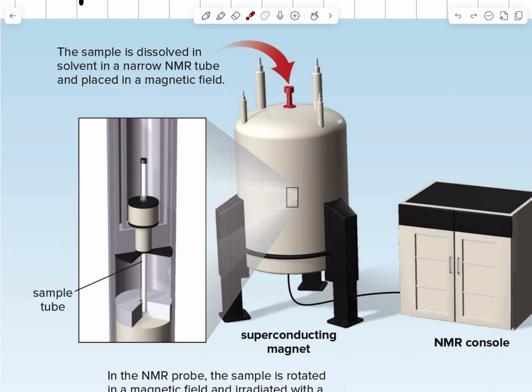Well, it would be really expensive to have to plug that in constantly, so the coils are made out of a metal that's superconducting at low temperature. You cool down the coils with first liquid nitrogen and then liquid helium. So this is basically a huge thermos, and inside is 4 Kelvin. That's where liquid helium is.